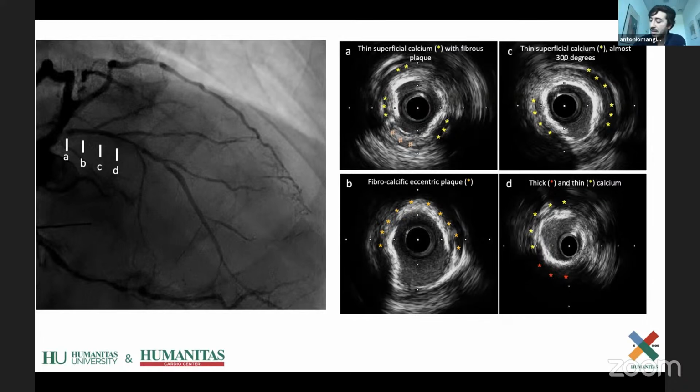Yeah. Patricia, any other tricks you have in these kinds of cases? Any tips and tricks when you have such diffuse disease and you're going to do rotablation? Well, it is a diffuse disease, but there is a subocclusion at the ostium of the LAD. So probably if you are able to open up the subocclusion, the vessel will appear a bit more treatable than it does now.